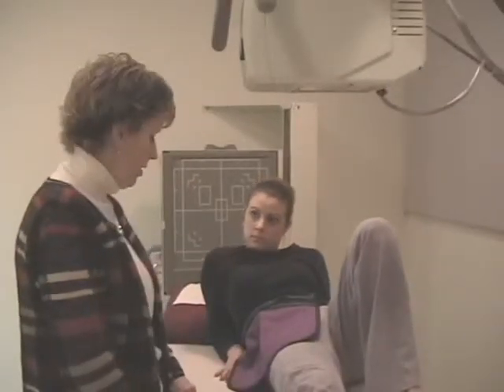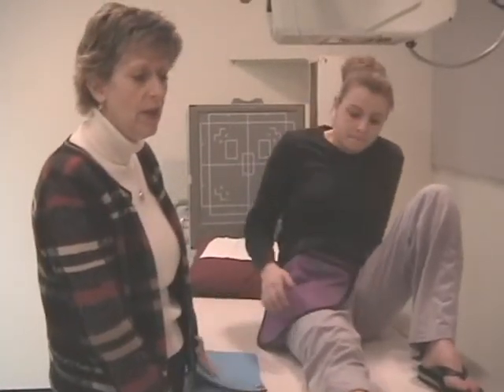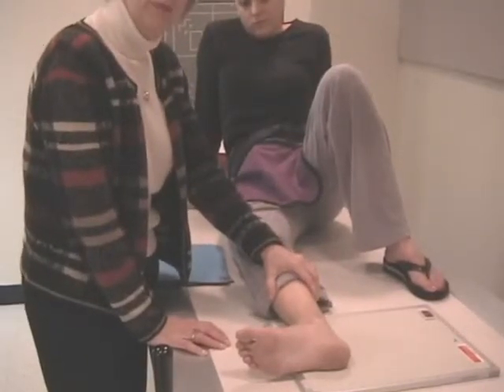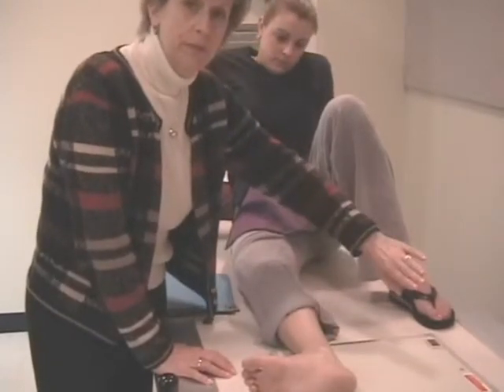We're going to kind of review with them, Jacqueline, our protocol here at YVC is a little different than the national protocol. National protocol, what's done in Seattle or what's done in Boise or what's done in Oregon, they may actually have the lateral flat, straight on the cassette. And if the foot is flat, straight on the cassette, the fibula will actually lie posterior to the tibia.